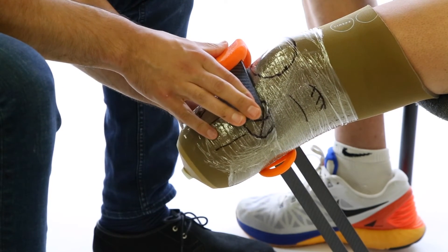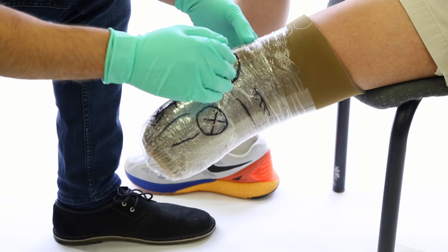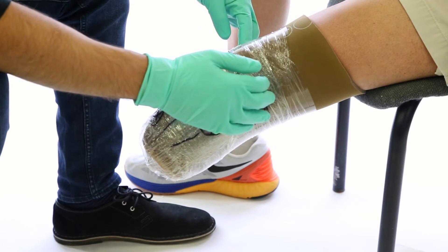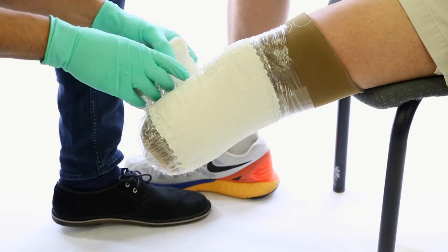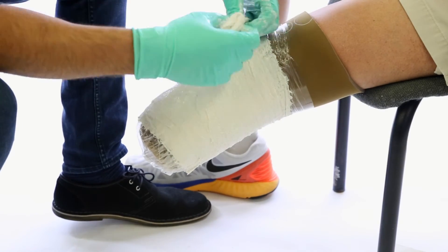We need to cast at the very least proximal to the condyles. We always recommend starting with a layer of elastic plaster, though you can choose to cast with fiberglass.